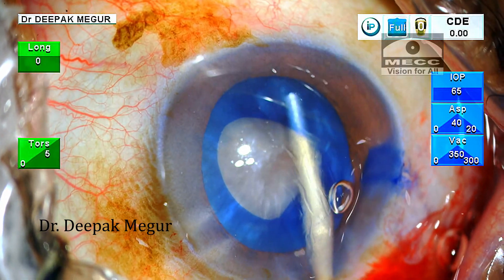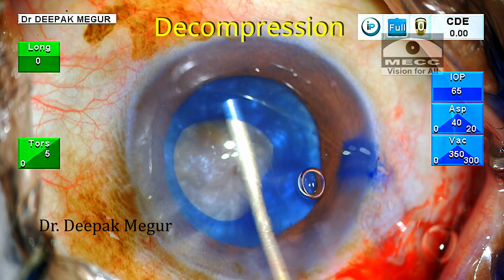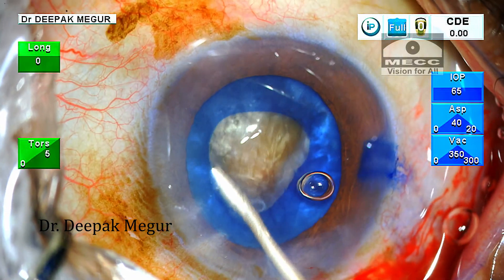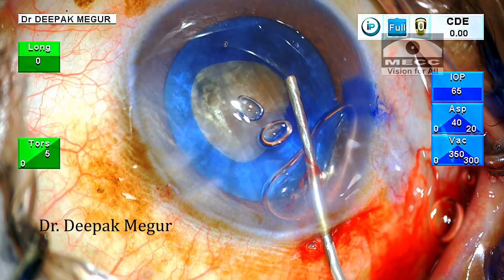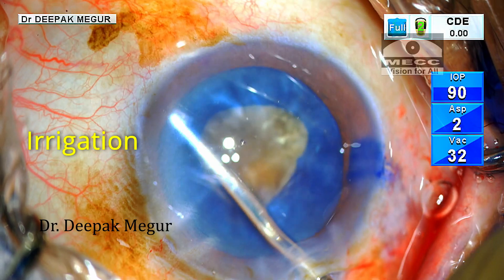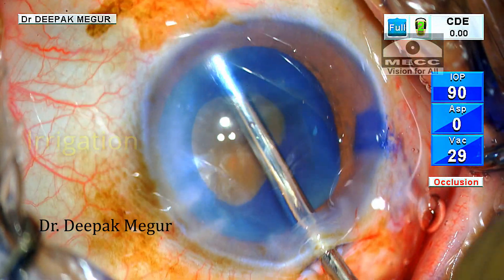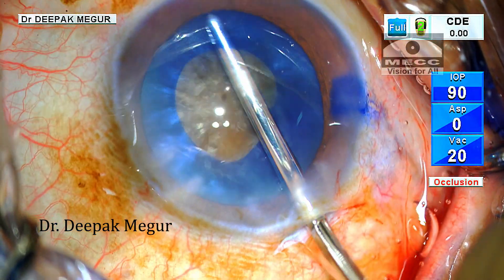Now I need to decompress the bag before performing the secondary large rhexis. Since many of these intumescent lenses have swollen lens fibers with a jelly-like consistency more like the epinucleus, I prefer to use a 23G cannula which comes with the viscoelastic HPMC. I use this to aspirate the swollen cortex, which comes off white easily. Once the visible cortex is aspirated from the entry surface of the nucleus, passive irrigation is used to burp out the swollen cortex hidden at the equator of the capsular bag or the fornices, and some of the swollen cortex behind the nucleus is gently nudged out by tapping the nucleus.